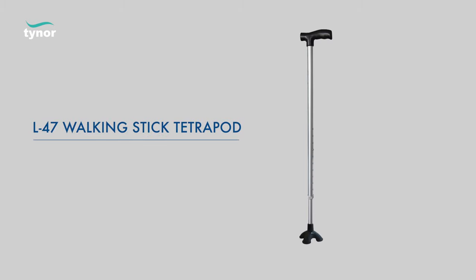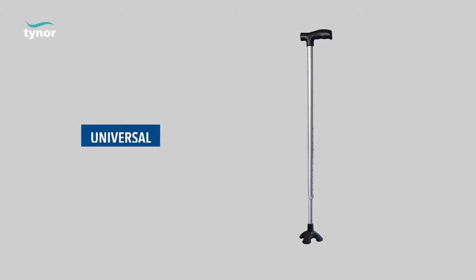Here we will discuss how to use the walking stick tetrapod. The walking stick tetrapod is available in universal size.